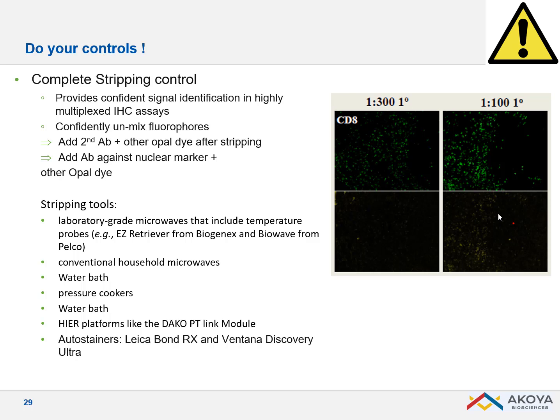Another approach: if you're staining a membrane marker like CD8, perform a second staining cycle after stripping using a nuclear marker. If stripping is complete, you should see no co-localization between the membrane marker and the nuclear marker.